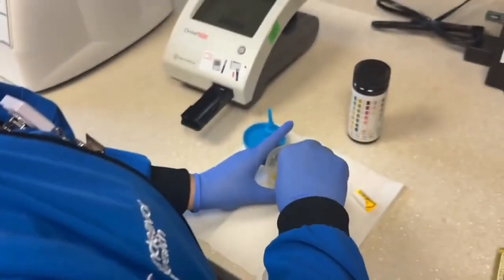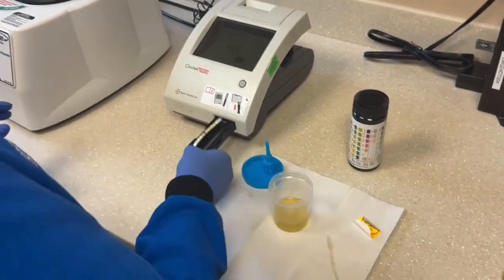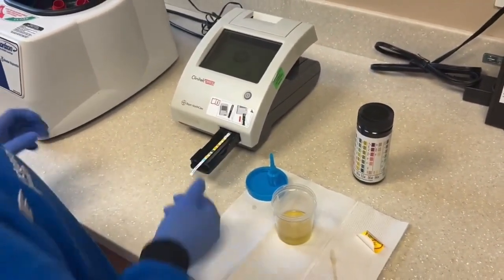Be sure to completely immerse the reagent areas of the strip in the urine. Drag the strip on the edge of the container and blot the strip on a paper towel to remove excess urine before placing it into the machine.